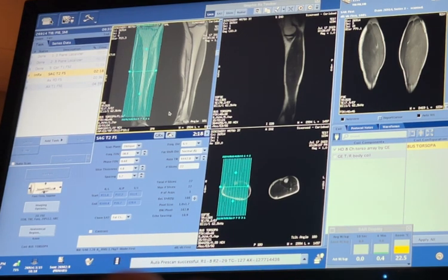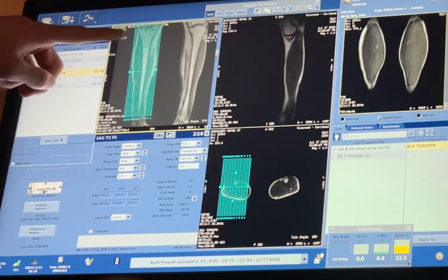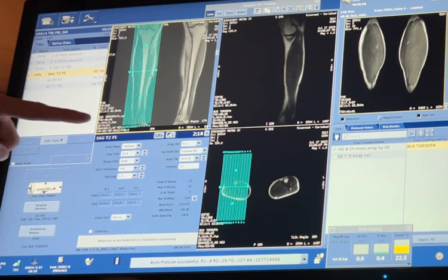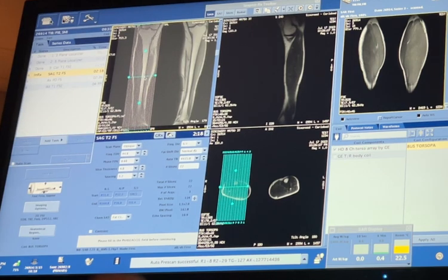So let's angle with that. Put the blue dots both right on it. It hides it, but we should still see it. Great, it's still there. Now let's scroll through. Actually, I'm going to have you increase your FOV. So 3. There you go. And then you're probably going to scoot it down a little bit so it kind of matches. So yeah, perfect.